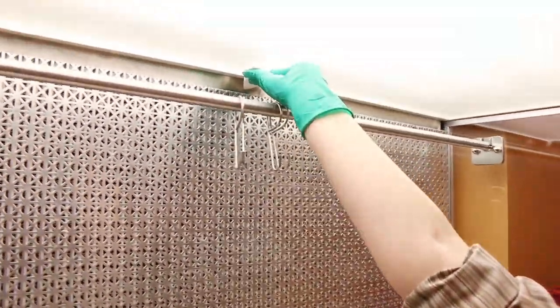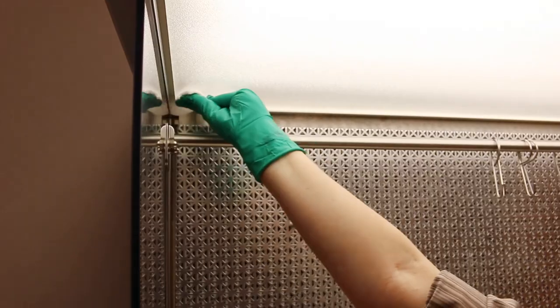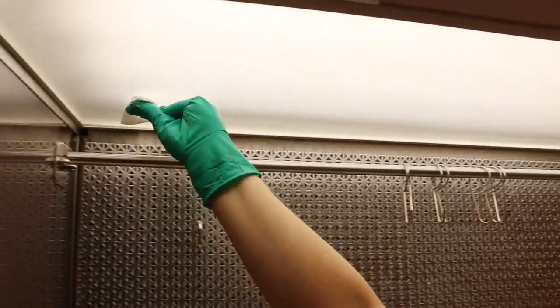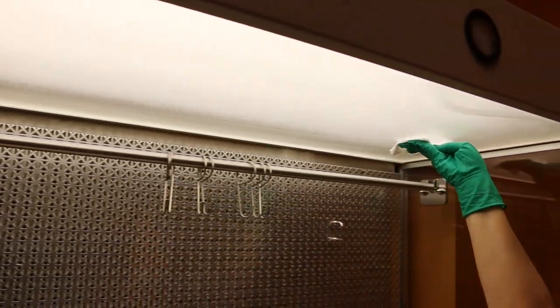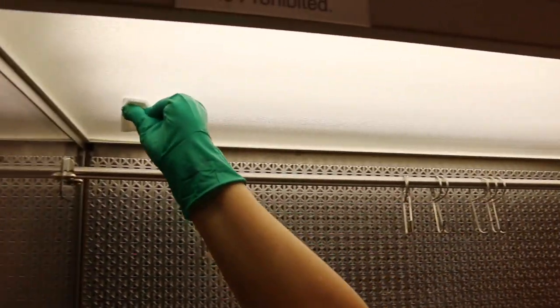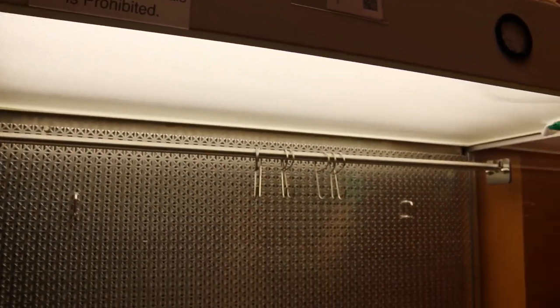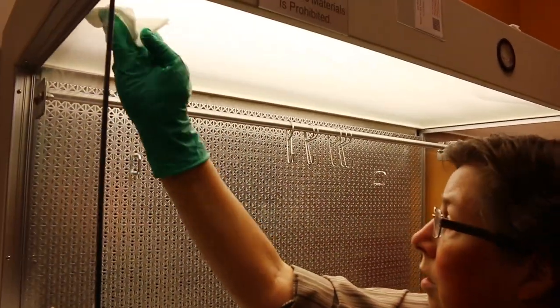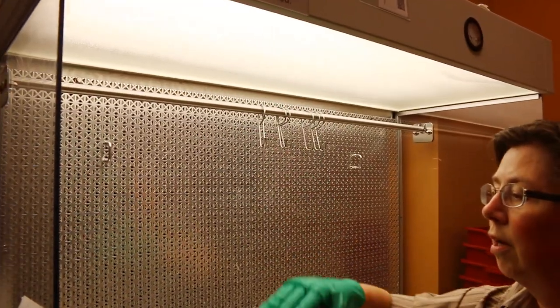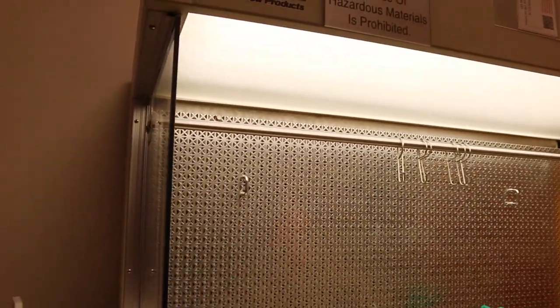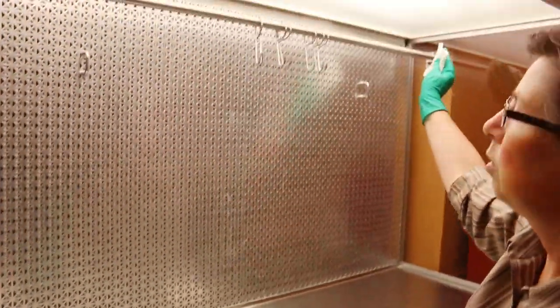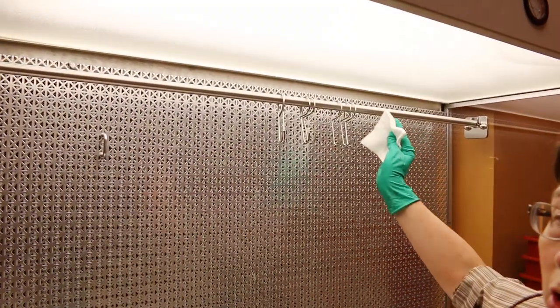Clean the ceiling from the back to the front with overlapping strokes. Once you come to the outside of the hood, that set of wipes is considered dirty.